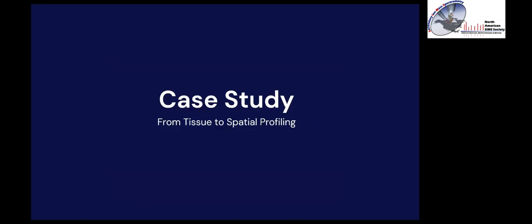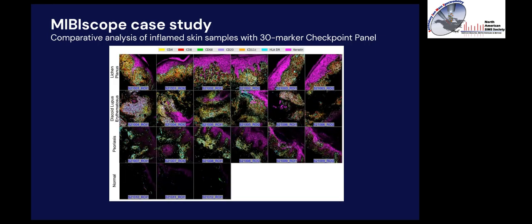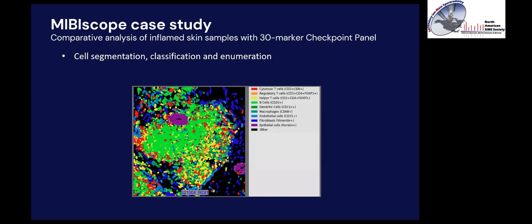Going back to the most general overview, what we can see is that the tissue structure does vary quite a bit between these different samples. And that's something we're going to aim to capture with some more quantitative analysis of the sample itself. The first step in that pipeline is that we need to segment the tissue image into individual cells. The whole point of this is we want to do single cell spatial analysis, so we need to know where the cells are within a particular sample.